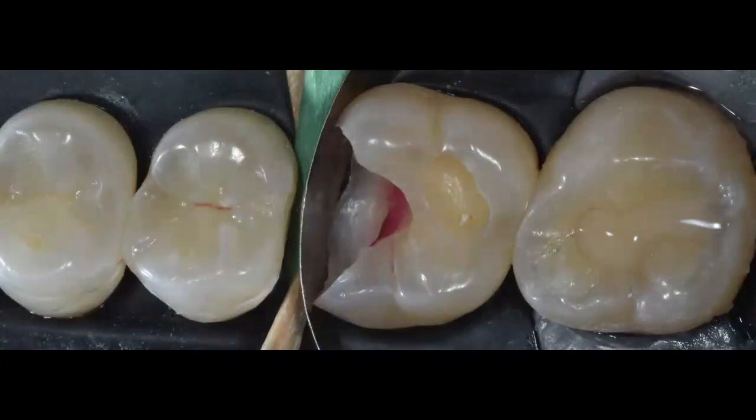So I want to make sure that I stay away from that, because I know that if I'm beyond the 3 millimeters, I am going to be very, very close to that pulp chamber. And I don't want to, again, expose in any way, shape, or form any of the horns or any of the pulp. So what you're seeing here is I'm trying to place a metal band just to elevate that margin.